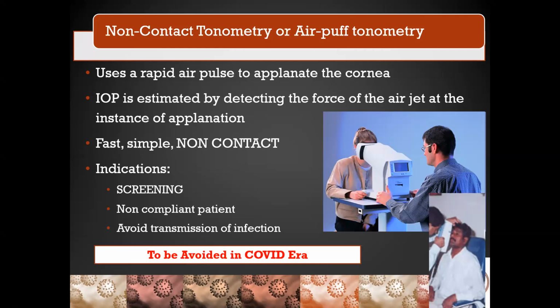But it is important to avoid it in this era because it forms micro air droplets around the machine. So in the COVID era, where we need to be extra careful with this device, we don't use non-contact tonometry.